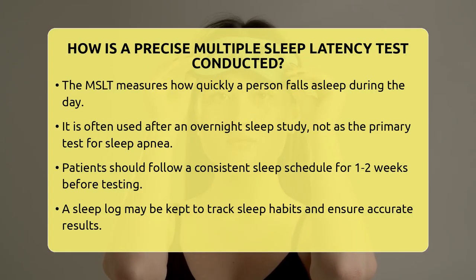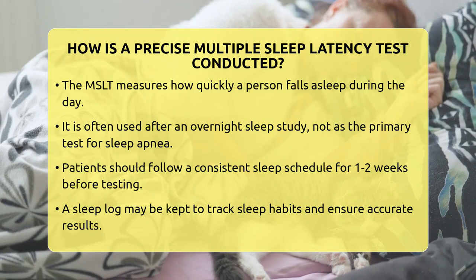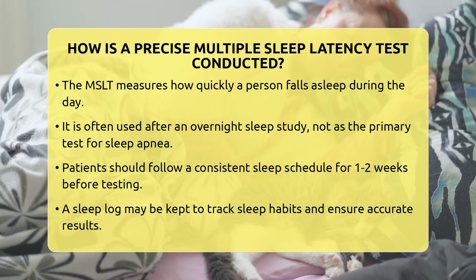How is a precise multiple sleep latency test conducted? Imagine trying to find out how quickly you fall asleep during the day. That's what the Multiple Sleep Latency Test, or MSLT, helps doctors measure. It's a special sleep test used to see how sleepy someone really is during the day.